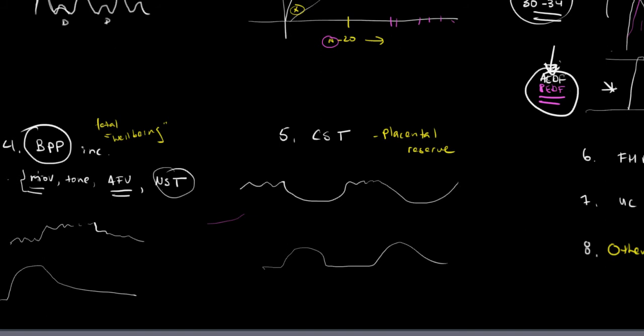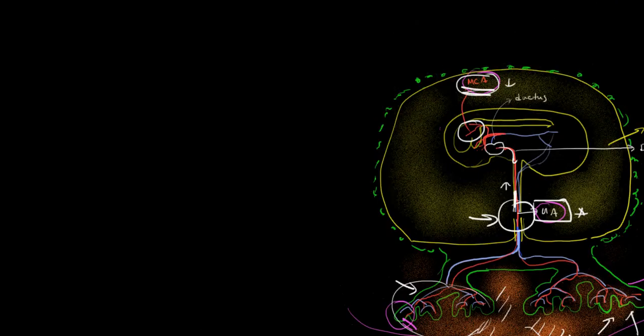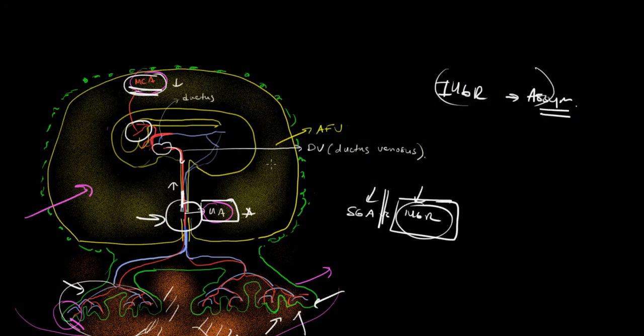We look at amniotic fluid volume. The reason we look at amniotic fluid volume is that it's a very chronic feature. It's part of the biophysical profile, and it's the only really, truly pure chronic thing in the biophysical profile. Amniotic fluid volume tells you the volume of amniotic fluid within the amniotic sac here. Babies with severe or progressive IUGR, when the IUGR is serious and there's not enough maternal supply, start to get something called oligohydramnios, which means decreased amniotic fluid.